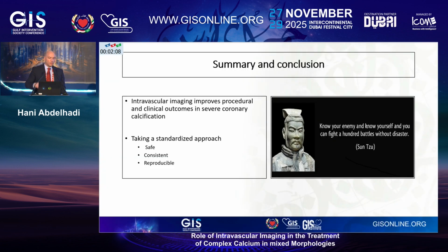So to summarize, intravascular imaging improves both procedural and clinical outcomes in severe coronary calcification. If you take a standardized approach, you're safe, you're consistent, and you have reproducibly good results time after time. Know your enemy, know yourself, and then you can always have a good outcome.